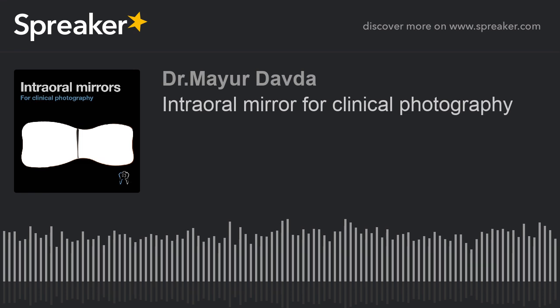But the technique that I use the most is just asking the patient to keep the mouth open for at least 40 seconds before you actually put the mirror inside the patient's mouth. This 40 seconds to 1 minute will give an opportunity for the moisture to evaporate. See to it that the patient does not close the mouth at this particular time.